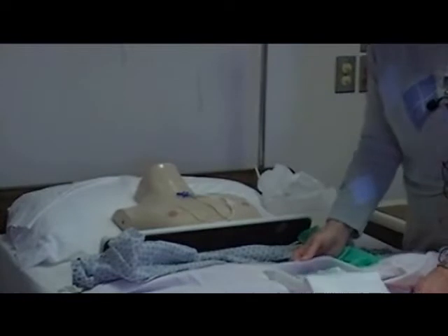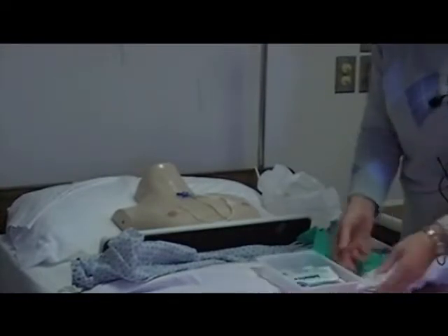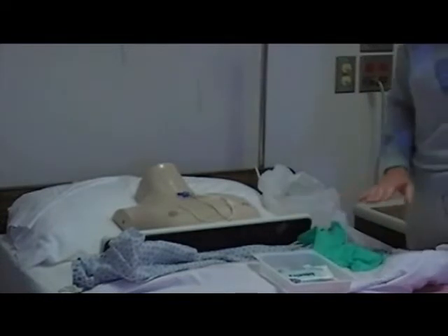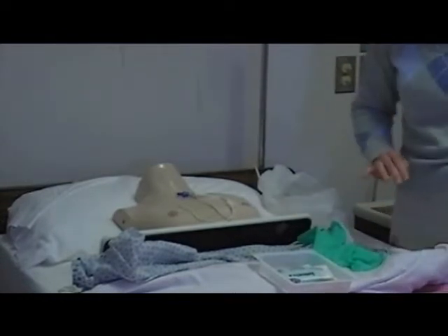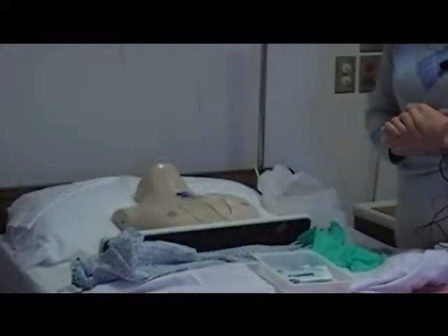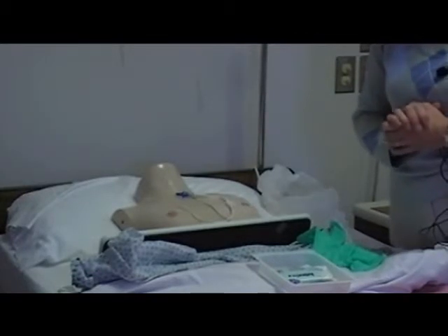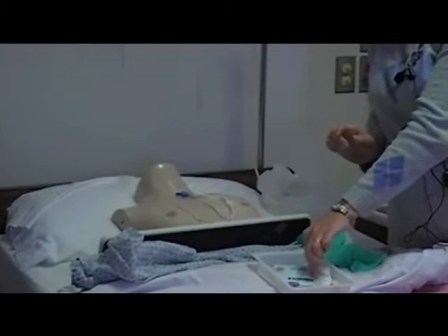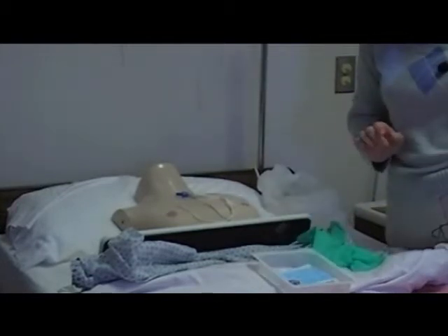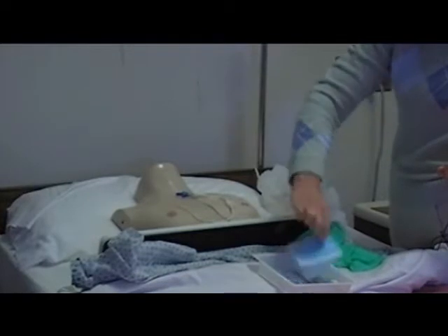I've opened up my kit. I have it setting on a good spot. If I could bring my table over, I'd put it on there, or here so that you can see my contents. I've left it on the bed. Okay. Now there are sterile gloves in this kit. I'm not using the sterile gloves yet, but I'm going to take the sterile gloves out so that I can get at my mask. They're still in their sterile package. They're good. We need a mask on.